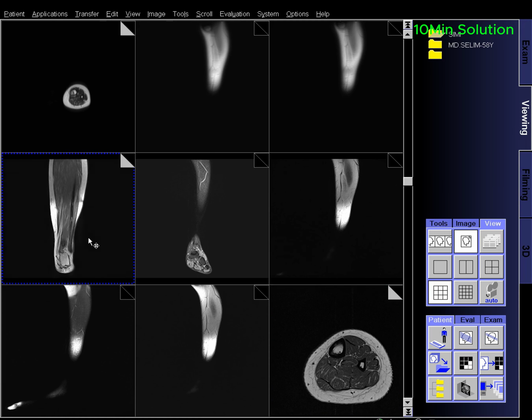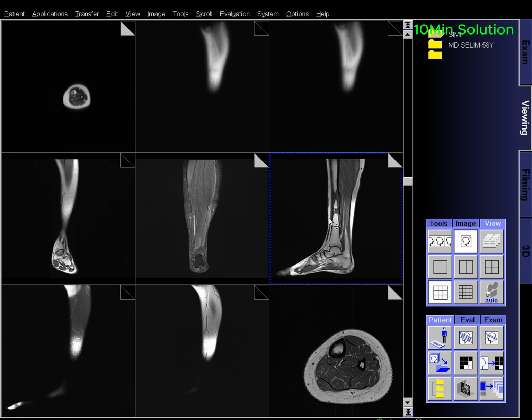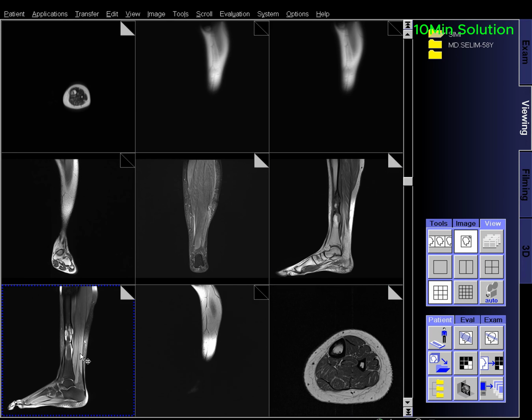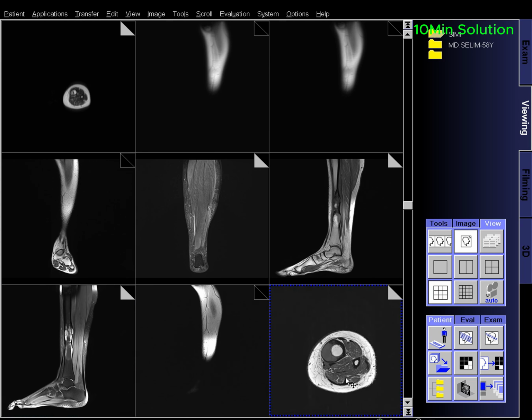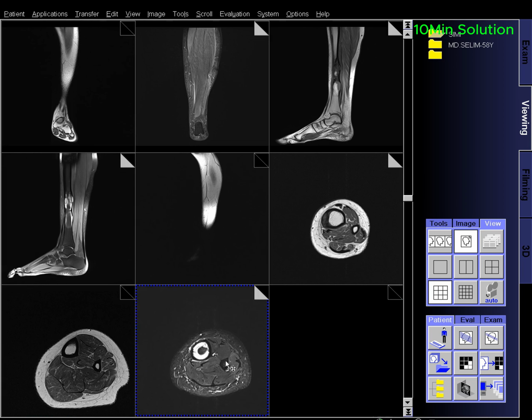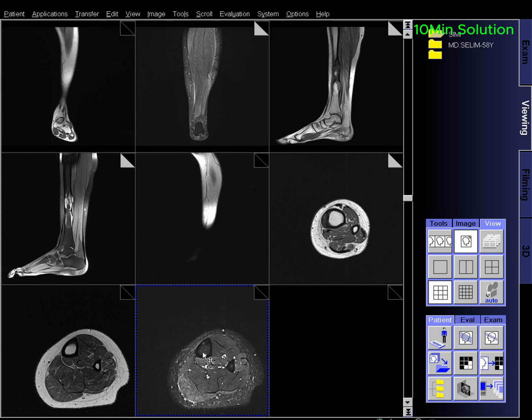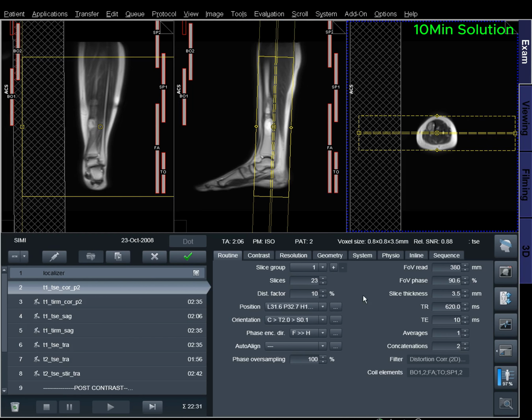Today we'll learn how to plan MRI of the lower leg step by step. This scan is extremely important for evaluating muscle injuries, bone marrow edema, fractures, and soft tissue lesions. In this video, I'll show you how to plan the sagittal, coronal, and axial planes, and how to improve overall image quality for better diagnosis. So let's get started with MRI of lower leg planning.